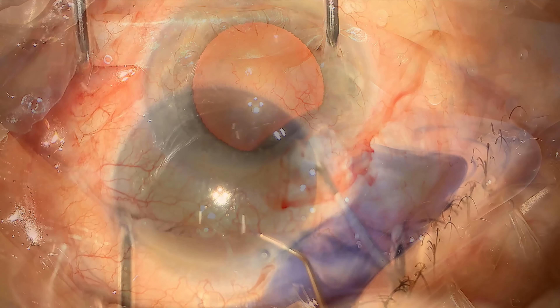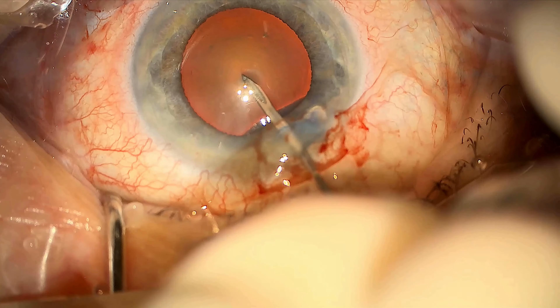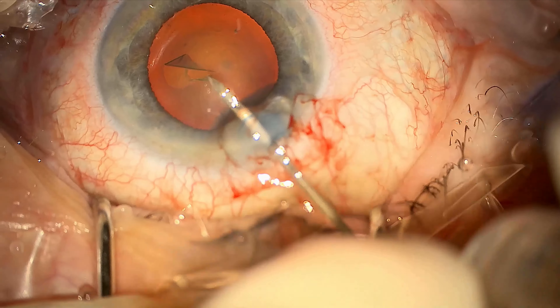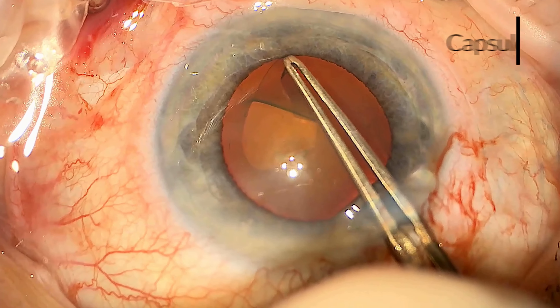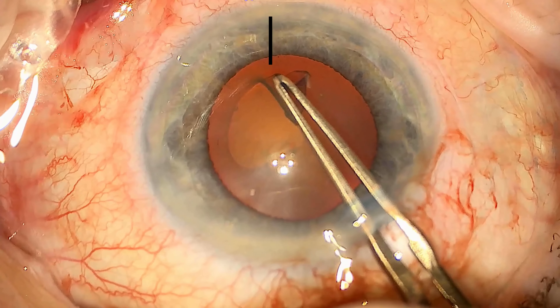I'm then using some vision blue to stain the capsule, or the bag where the cataract is held. With a small 25 gauge needle I'm puncturing the capsule and making a small flap. Once the flap is made I can use some forceps to create a small circle, or capsular rhexis. This gives access to the cataract for removal.